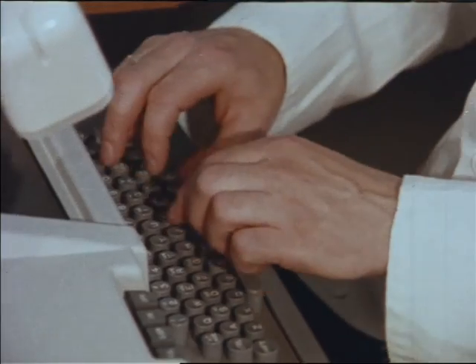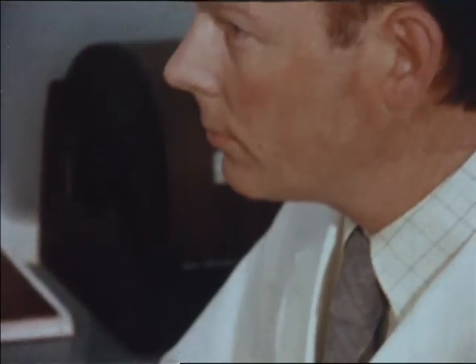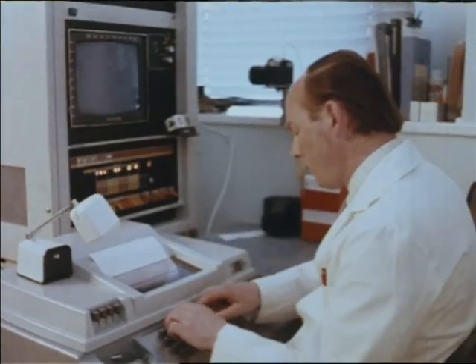After only a few puffs, the effects of nicotine can be seen. The fingers, once yellow, soon change to purple. They're getting much cooler, probably due to a reduced blood supply. At the Royal Arthritis Hospital in Bath, they're using this system not just to watch, but to measure.